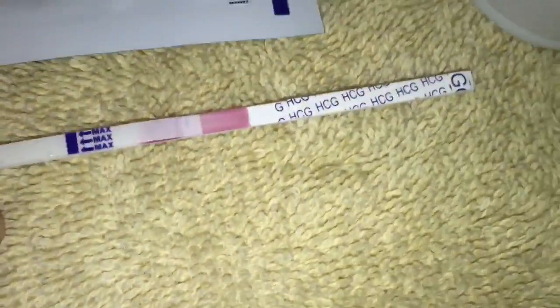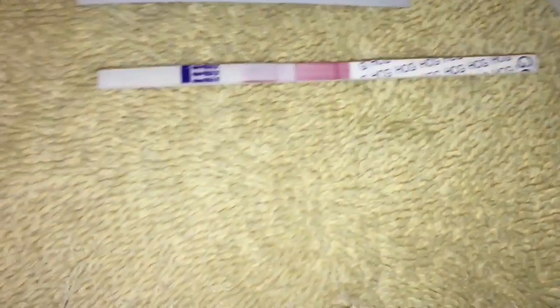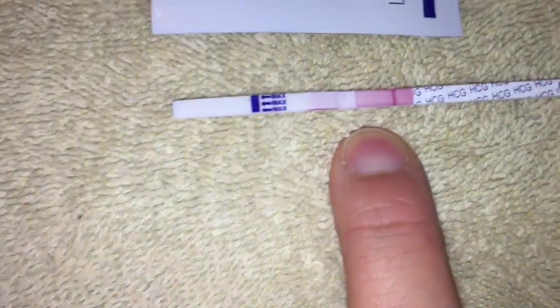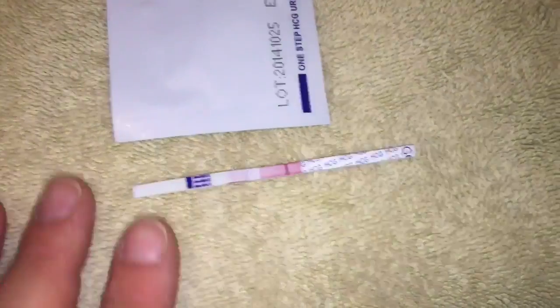I'm going to dip this in for five seconds: one, two, three, four, five. Then you lay it flat. They say you're supposed to read it after five minutes — make sure you always follow the instructions on your specific test. As you can see here, the control line came up and no other line, so that means not pregnant.